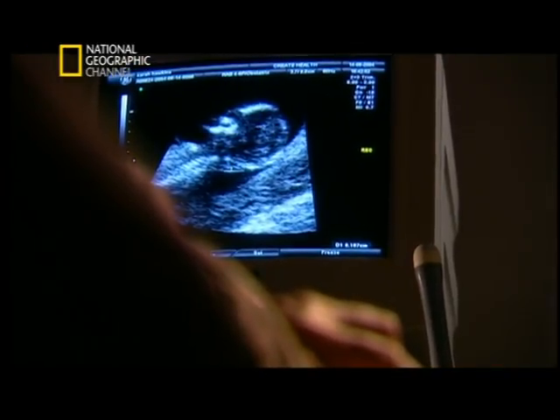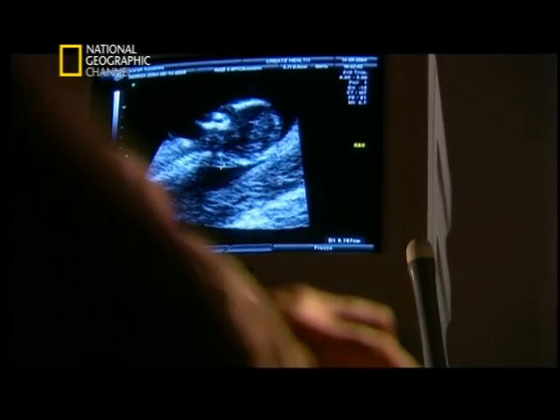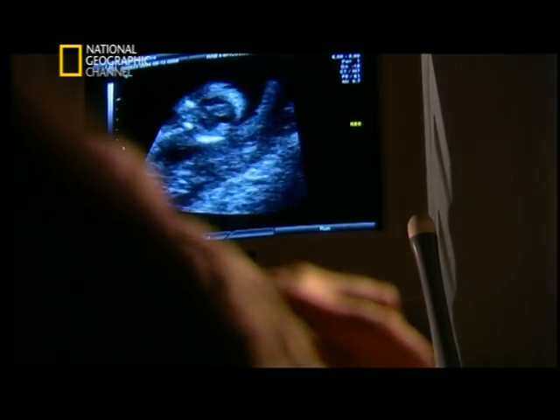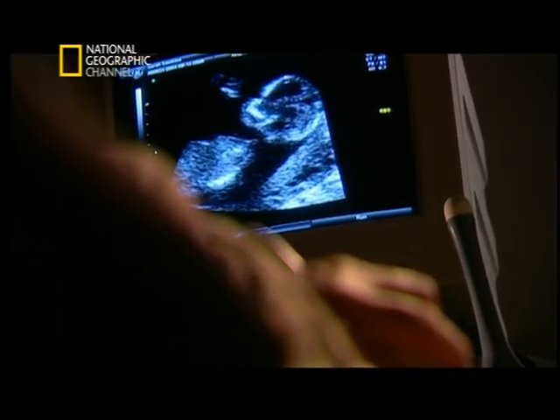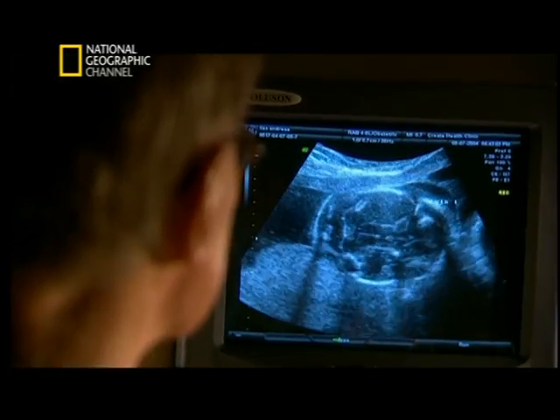Ultrasound waves don't travel well through air, so the scans are less effective looking through an adult stomach or intestine, for example, which are riddled with air pockets. But inside the womb, the fetus lives in fluid. Even the lungs are filled with fluid, and the ultrasound produces a moving image, which to a trained operator will reveal much about the health and development of the fetus. We have to make sure.